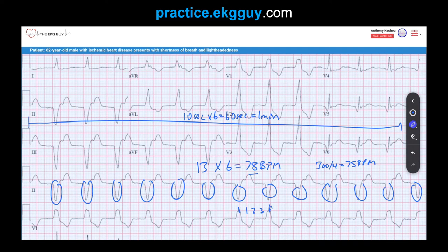The patient's history of ischemic heart disease also favors a ventricular over a supraventricular origin. When you have a wide complex rhythm in the context of ischemic heart disease or prior myocardial infarction, you should be considering a ventricular source until proven otherwise.